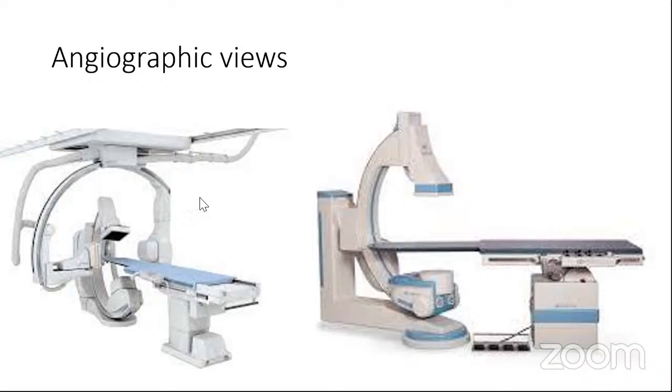However, sometimes it can prove difficult to get the exact angles that we require, right? Because both C arms will collide with each other, and that is the advantage of the monoplane, that it can move freely.